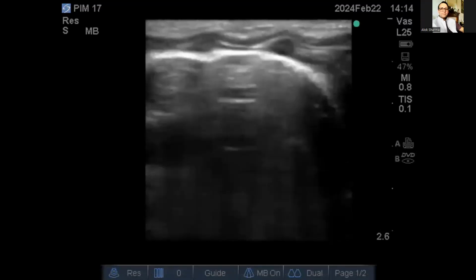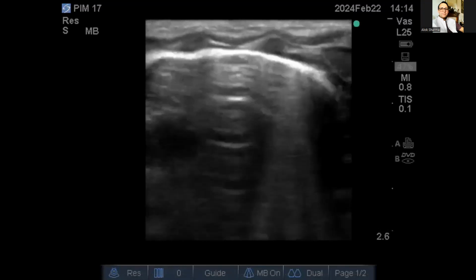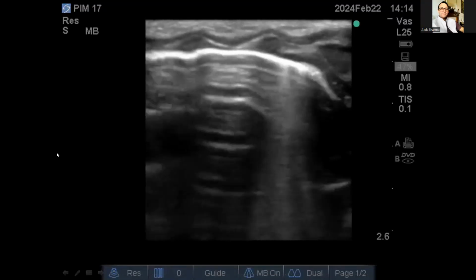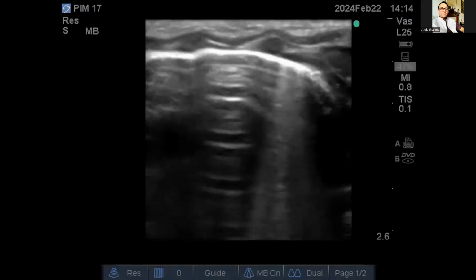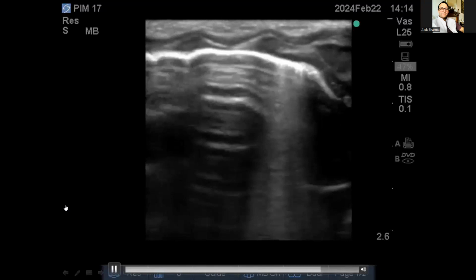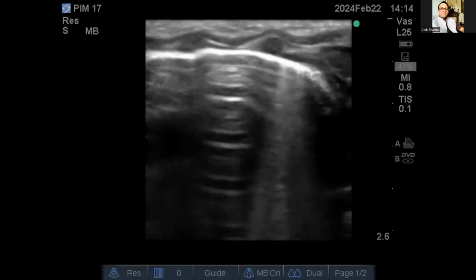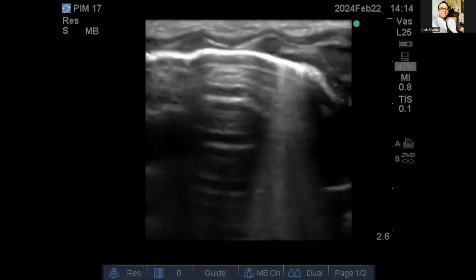My only comment is mild RDS will have areas of lung sparing. There will be areas of aeration of the lung. And the real question you're asking is, this is your first lung ultrasound. If you had done this a little bit earlier, under 2 hours, and you're getting this appearance at 3 hours with better aeration, and your baby's getting clinically better, then the question is whether this is just mild respiratory distress syndrome as opposed to moderate to severe, and whether this is improving. Because of the natural history of RDS, a lot of babies between 28 and 30 weeks, in the COIN trial, more than 50% got away without surfactant. So they will have a natural course of evolution where RDS evolves into aerated lung.